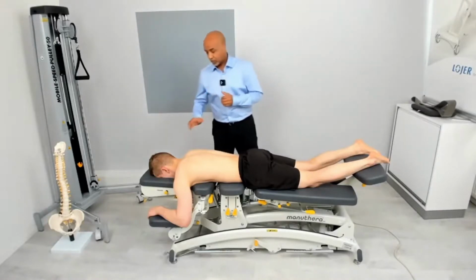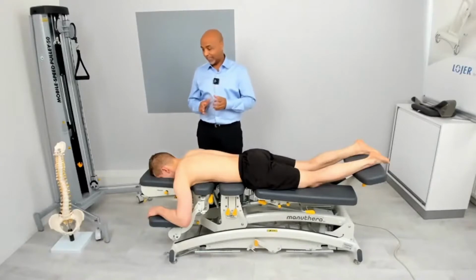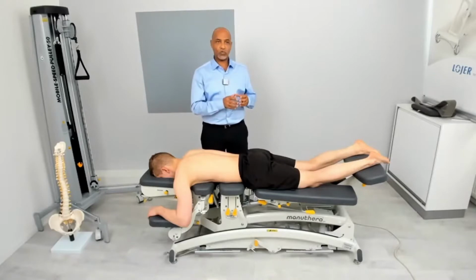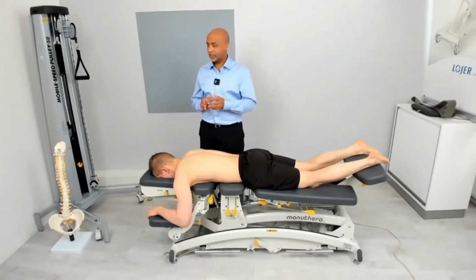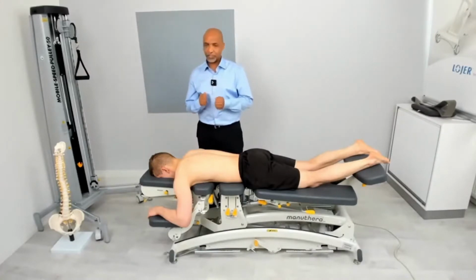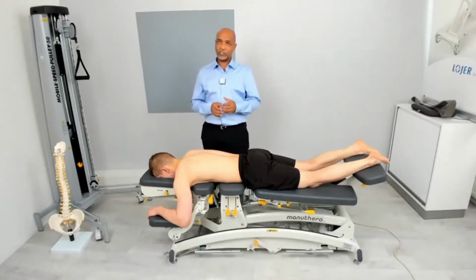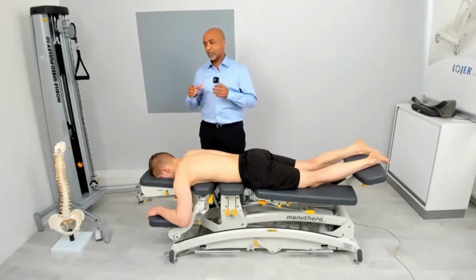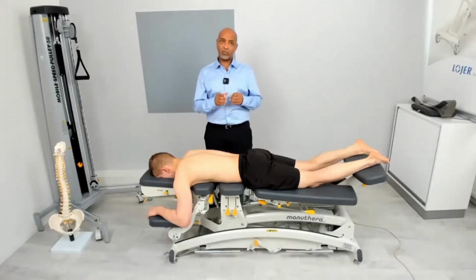For example, we have a lot of patients who come to you with pain. At the end of the day, we need to understand what the cause of the pain is. There are so many reasons pain will show up. It can be due to muscle stiffness or muscle imbalance, to joint malfunction or alignment, or to blood circulation and oxygen deficiency in the tissue. All that produces pain. So the Manuthera 242 helps us to find the root of the problem.